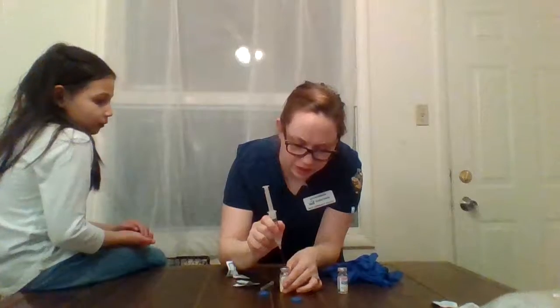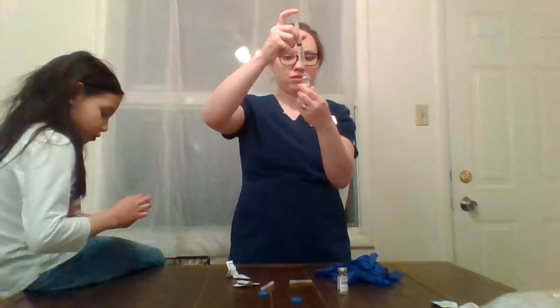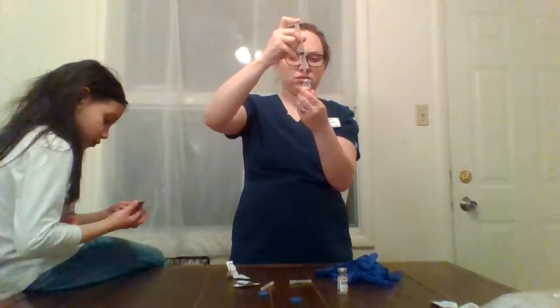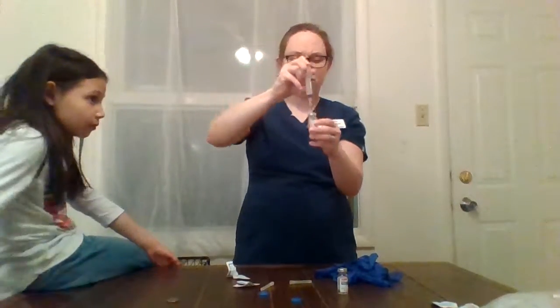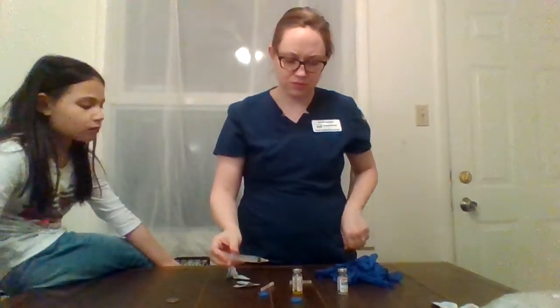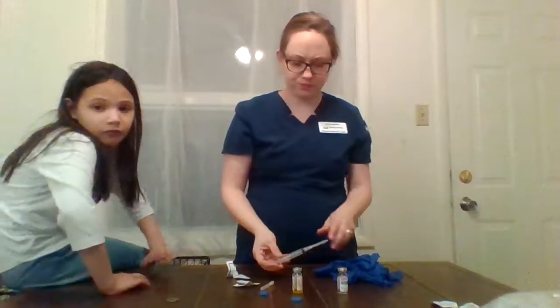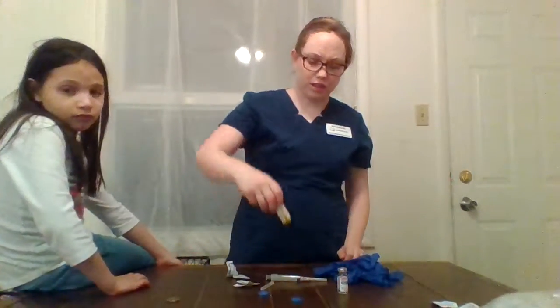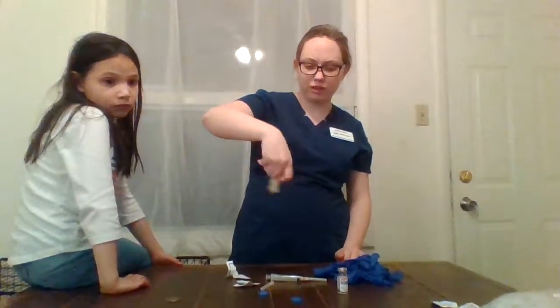Going to inject that into the medication. I'm going to swirl this to completely dissolve the medicine.